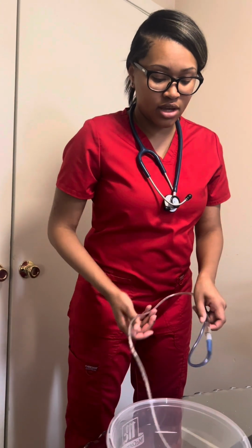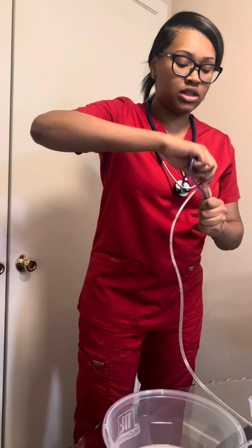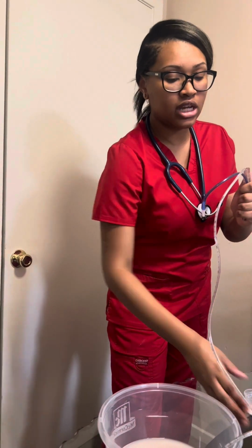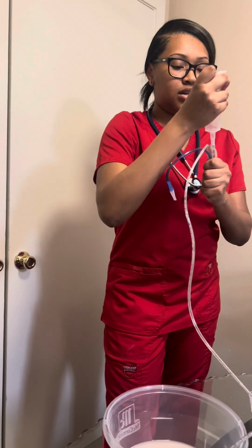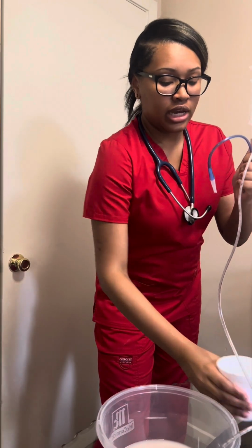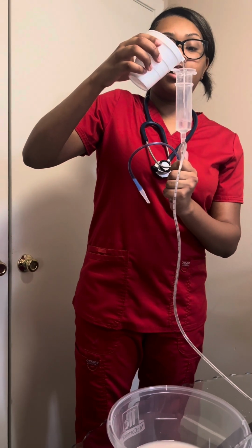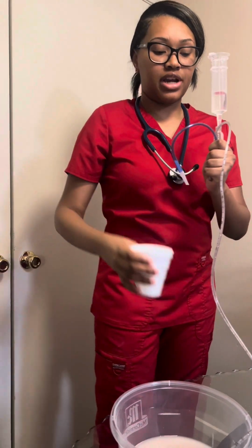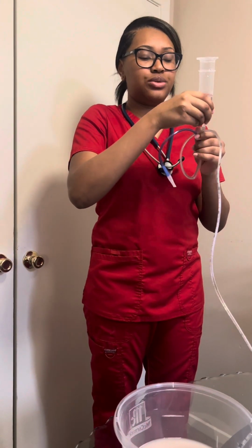And then I would clamp my tubing. And first, before administering the medication, I would put my syringe on here. And I will put 30 to 60 milliliters of water before administering my medication to flush the tube.